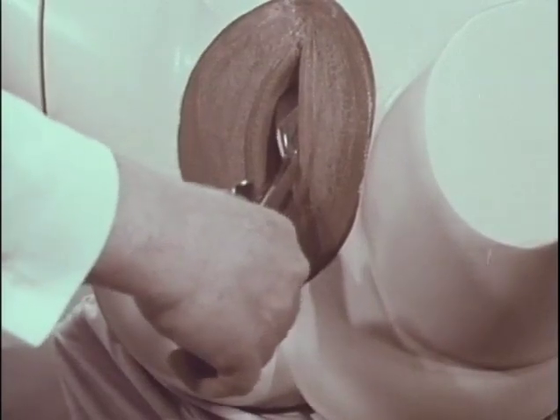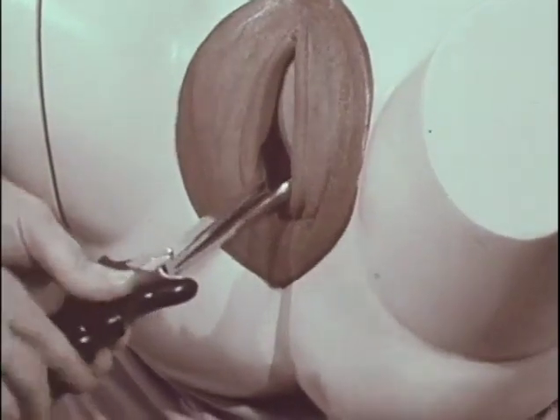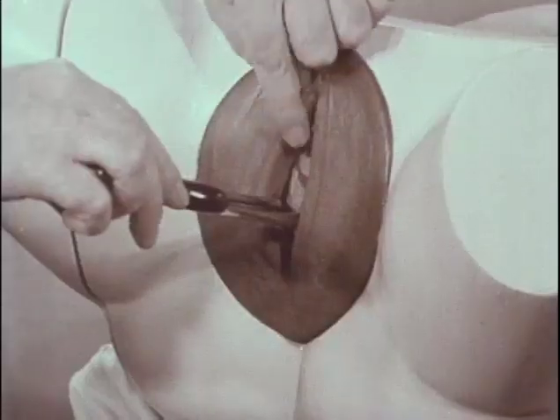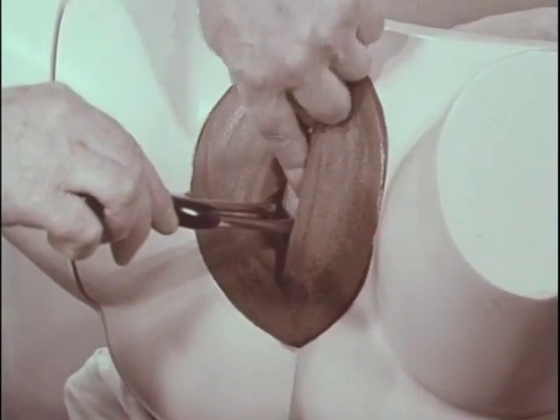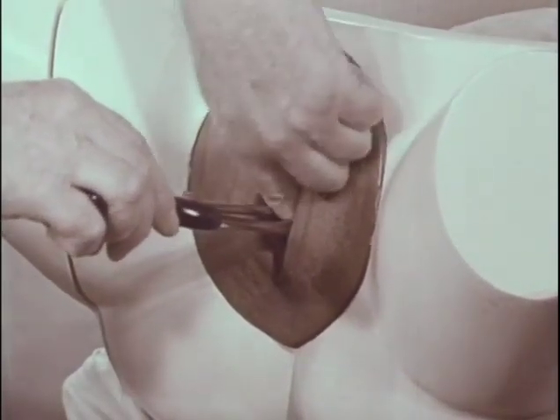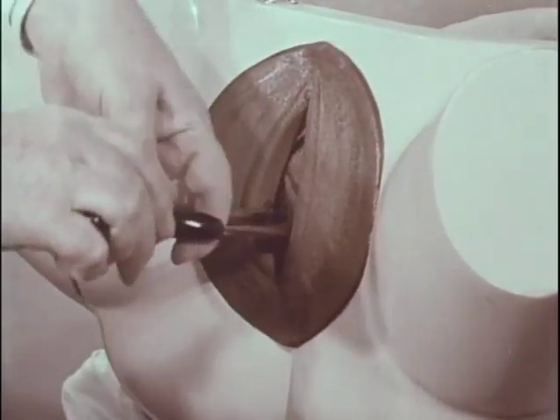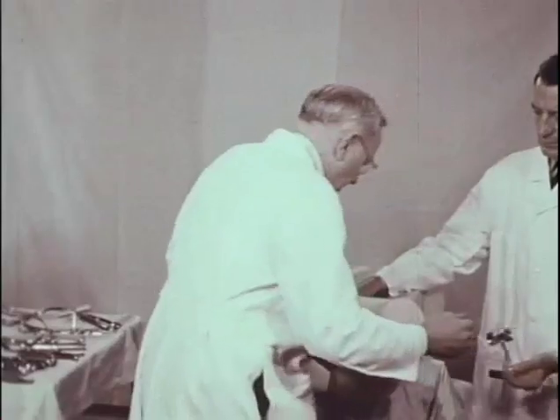And compression, flexion, rotation counterclockwise with depression. Now we check the application: the posterior fontanelle a finger's breadth from the plane of the shanks, the sagittal suture perpendicular throughout, no fenestration felt. And then proceed with traction.